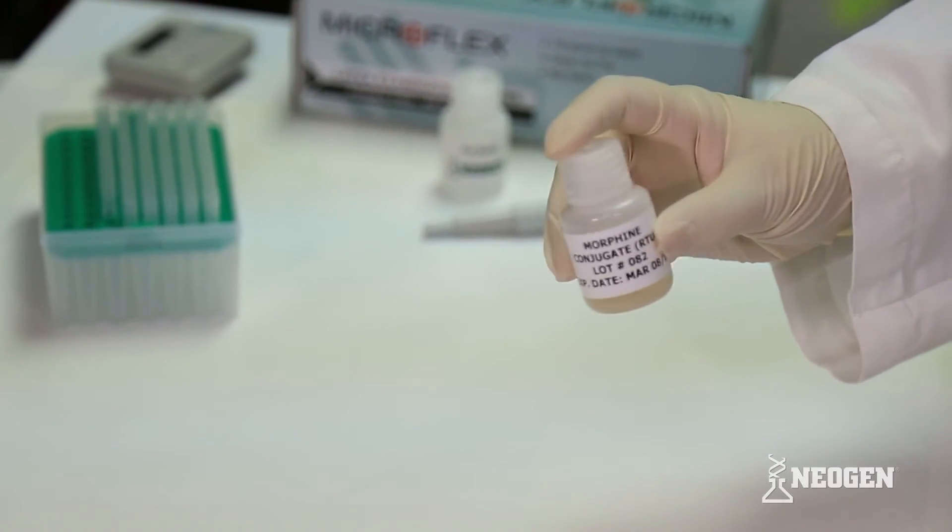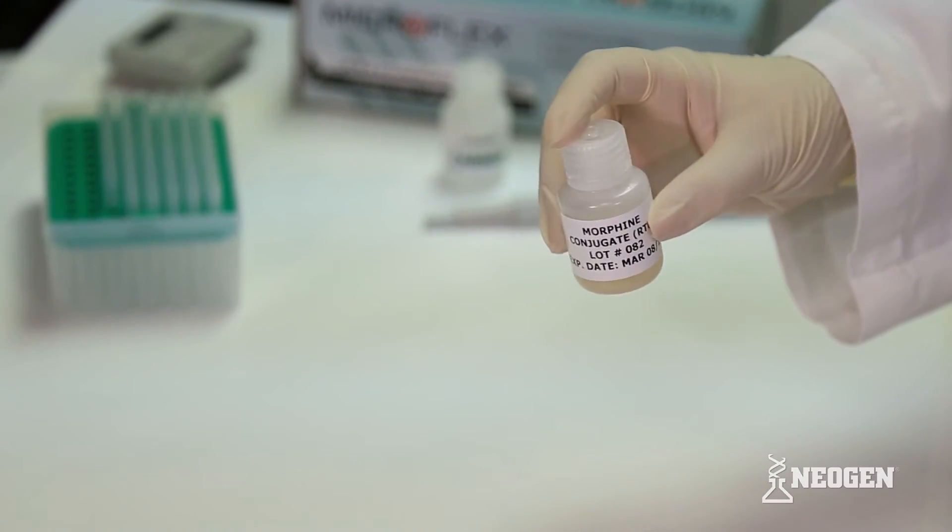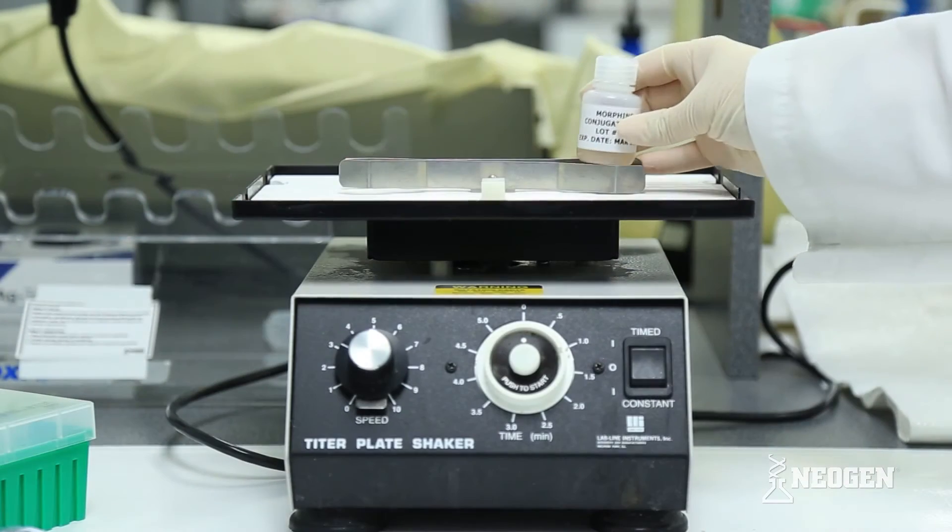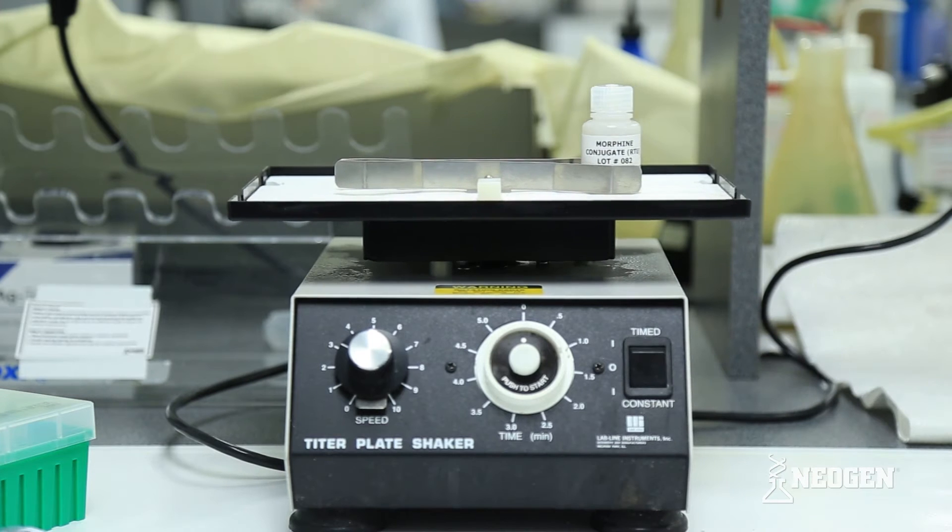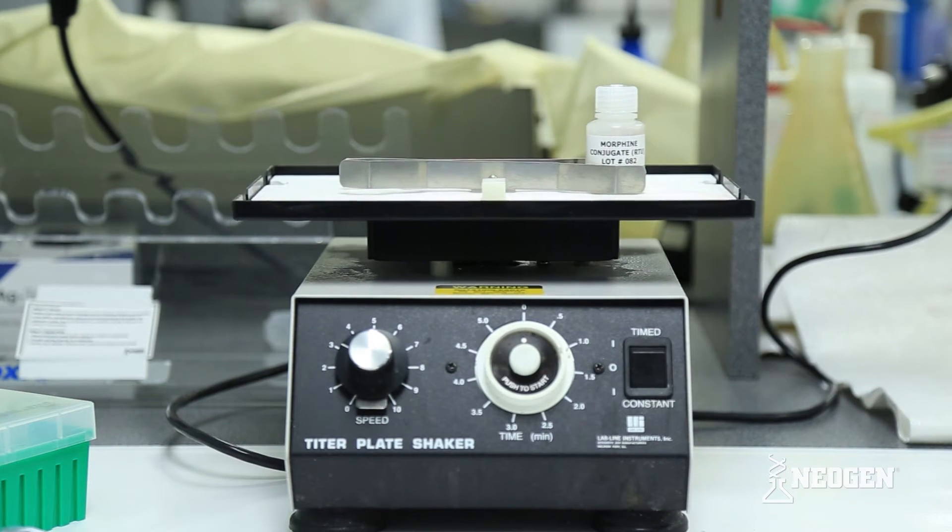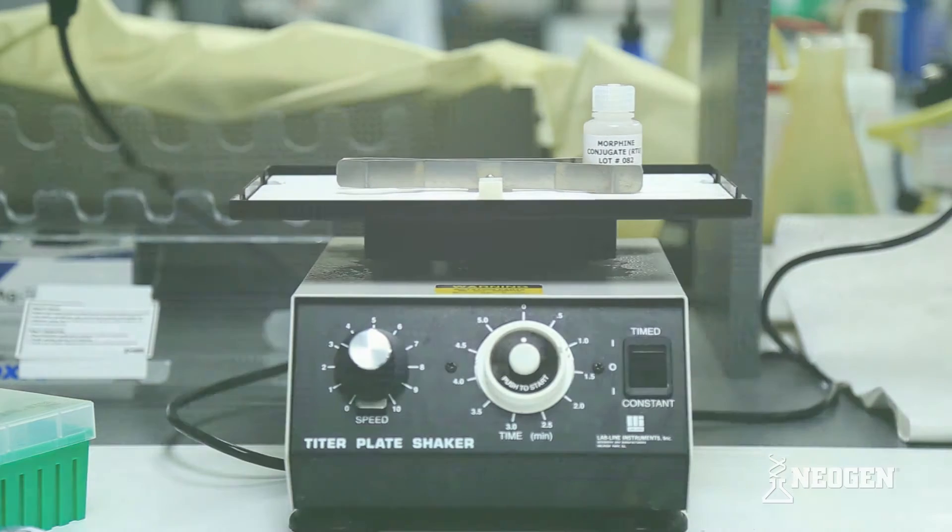Gently mix the ready-to-use conjugate solution by inverting the bottle a minimum of 15 times or by placing the solution on a rocker for 5 minutes. Do not vortex or shake this solution vigorously, as this will compromise the integrity of the conjugate and thus your results.